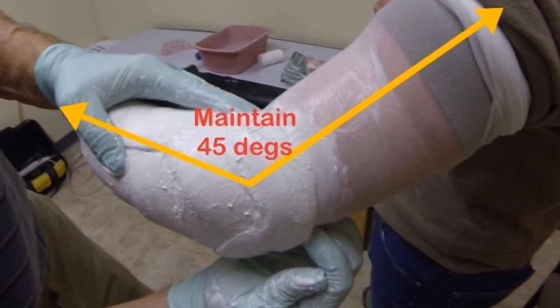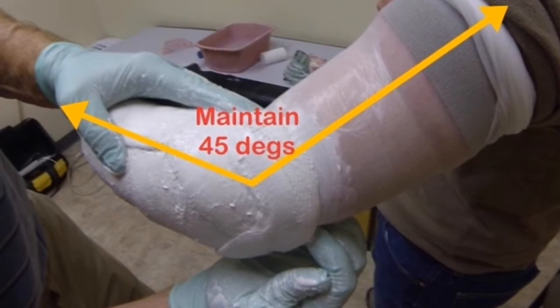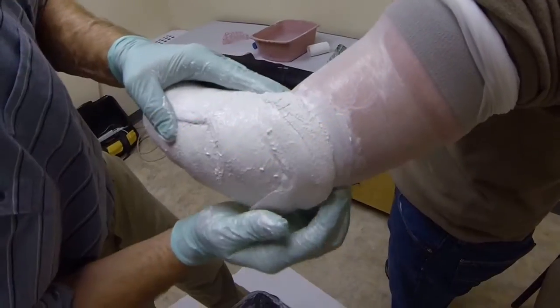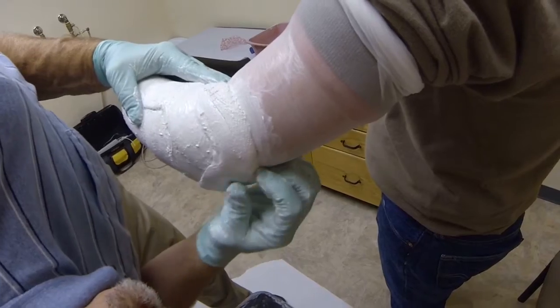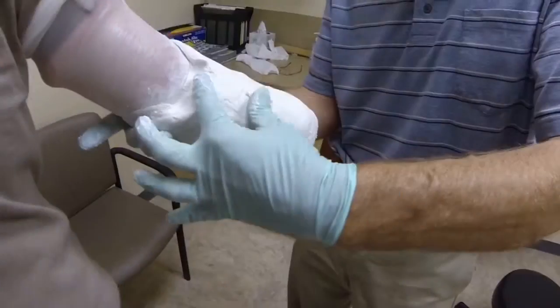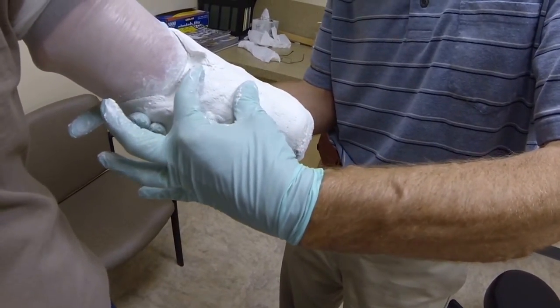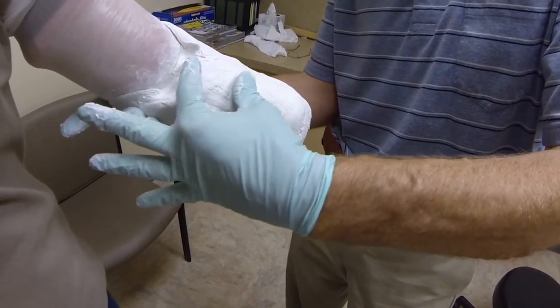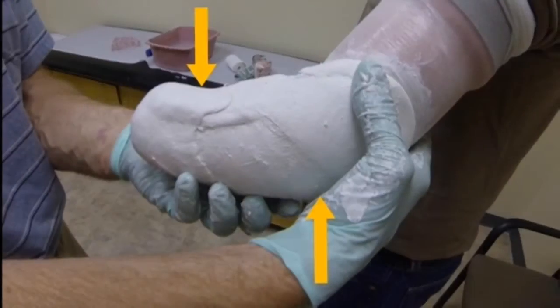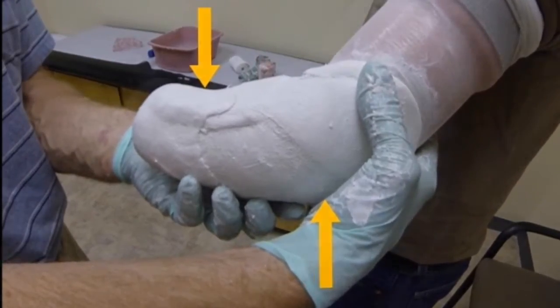Make sure that the elbow is maintained in a 45-degree flexion angle throughout the casting. As the plaster sets, mold the plaster slightly proximal to the cut end of the radius. This will help relieve this sensitive area and create an intimate fitting to avoid loss of motion during lifting.